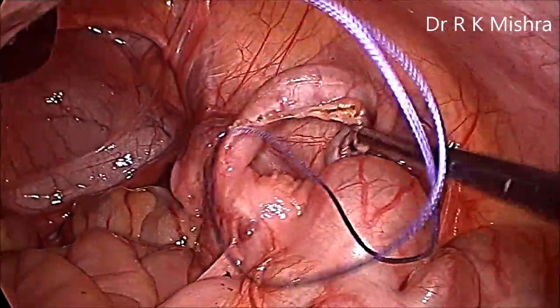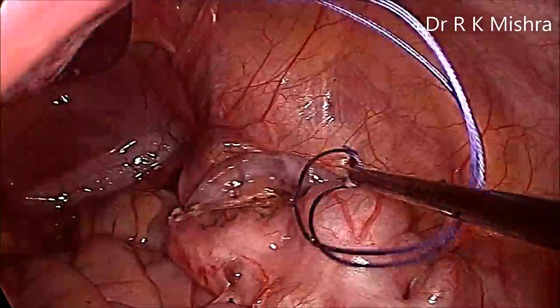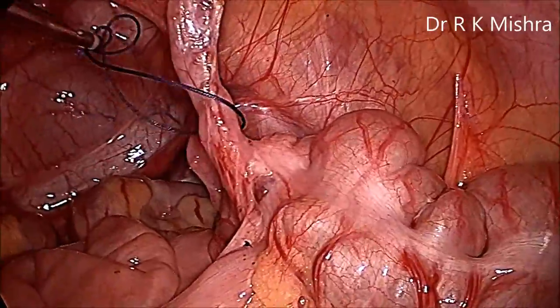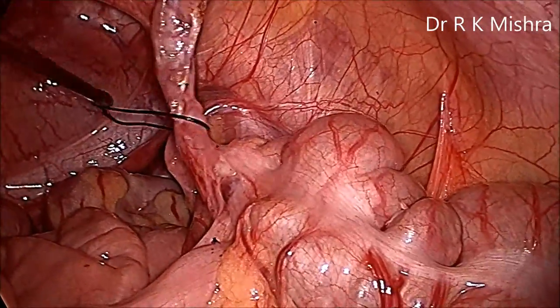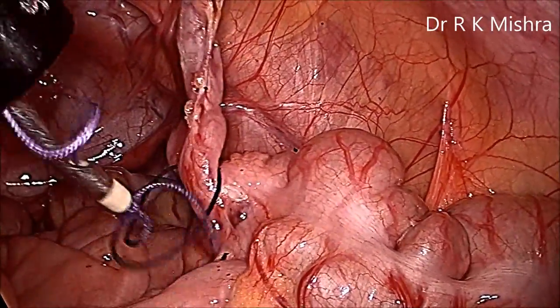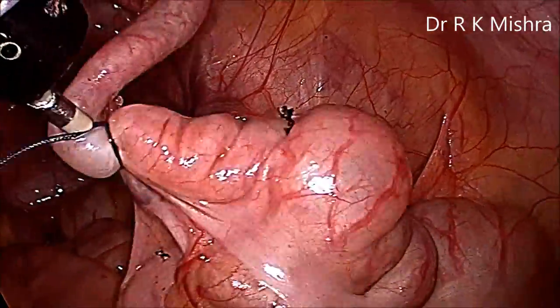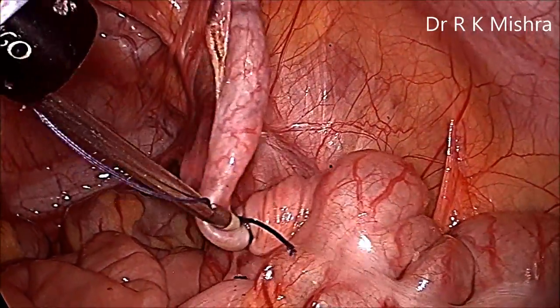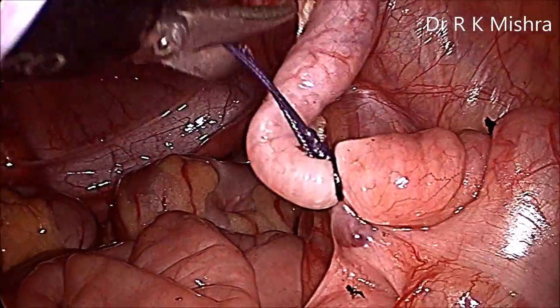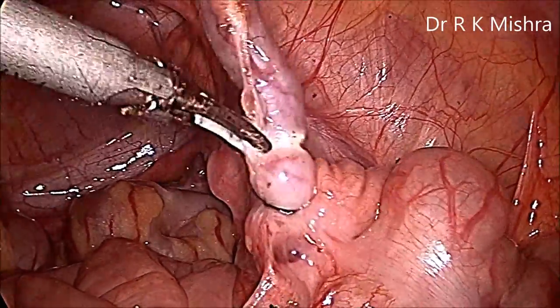Use a pre-tied Misra's knot, that is an endo-loop knot. Put it and catch the appendix, then pass this loop by the knot pusher behind the structure. Bring the tip of the knot pusher over the taenia coli so that it will automatically go there. To prevent incomplete appendicectomy, keep the tip of the knot pusher over the taenia coli; as soon as you tighten it, it will automatically go to the junction. Only one knot is more than sufficient. Bring the scissors and cut.